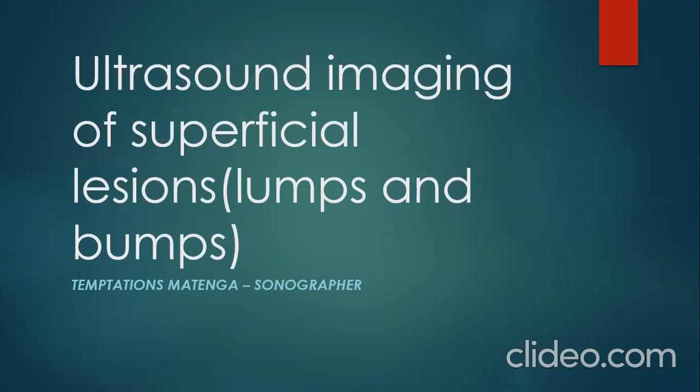Good day. My name is Temptations Matenga. I'm a sonographer at United Flower Hospitals in Zimbabwe. Today we're going to talk about ultrasound imaging of superficial lesions, and to be specific, the lumps and bumps. There are so many lumps and bumps that I'm not going to be able to exhaust all of them, but I'll try to talk about the most common lumps and bumps that we encounter in our clinical practice.